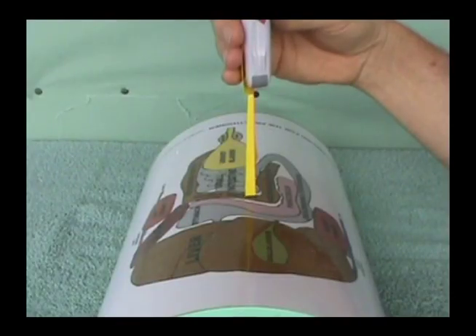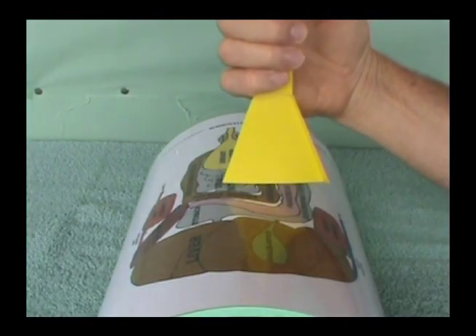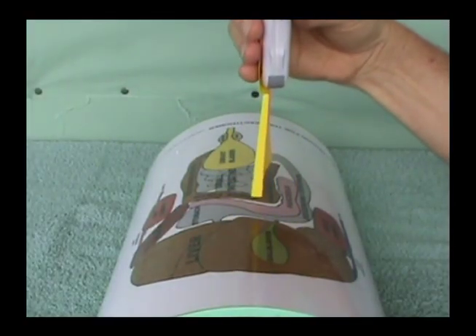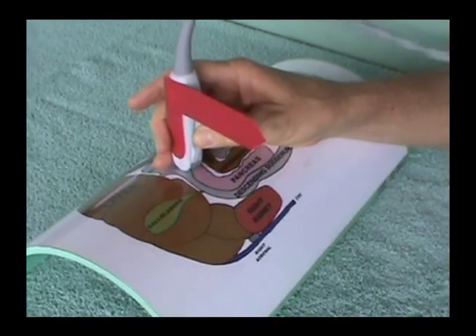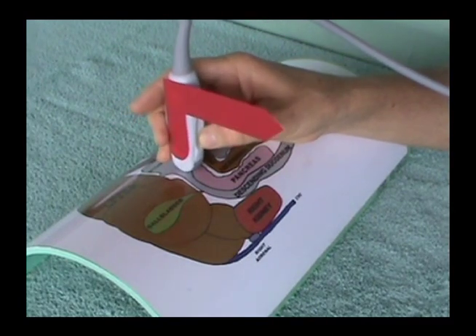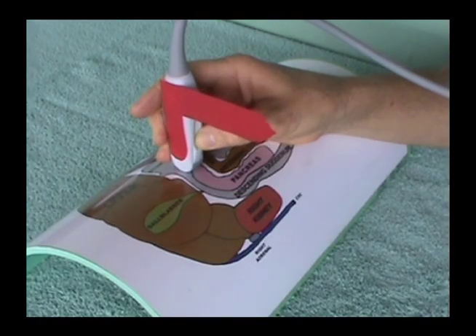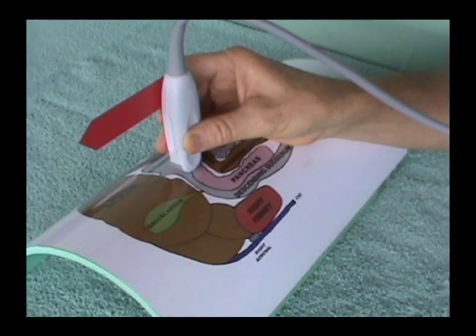In ultrasound, rotation is a partial circular movement from a point of fixation. The transducer's point of contact on the patient's body does not change. The most common form of rotation is a 90-degree counterclockwise movement from a sagittal plane to a transverse plane, and then reversing clockwise back to a sagittal plane.